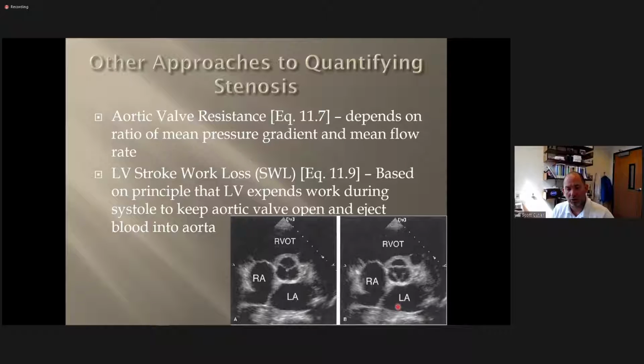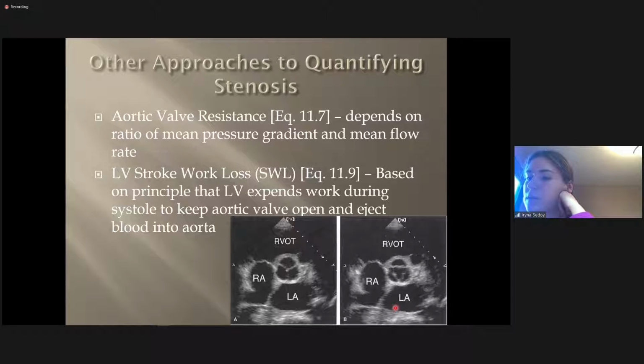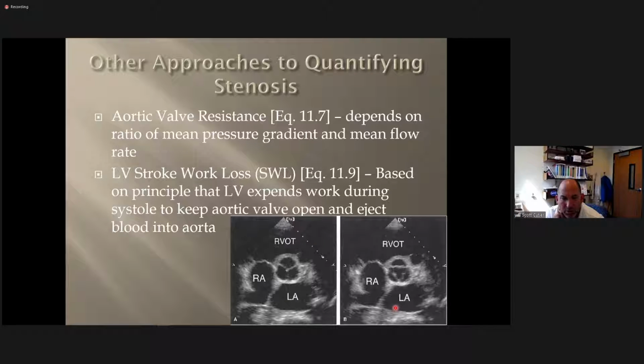So describe this valve to me. So this is presumably valve closed, valve open, calcified. Valve is open. Okay, so we will assume that the one on the left is a normal valve, has normal thickness. It's coapting all the way, it's shutting all the way. So let's just assume that the picture on the right, and I don't have the description in front of me here for this.